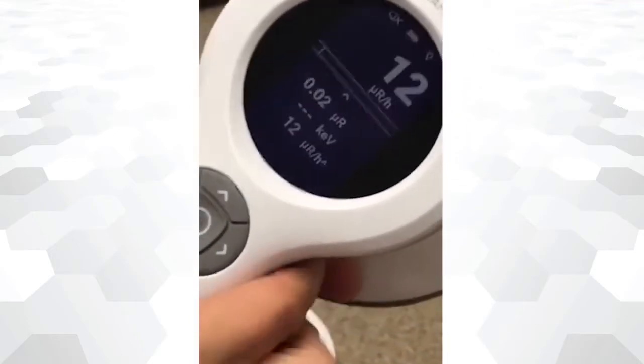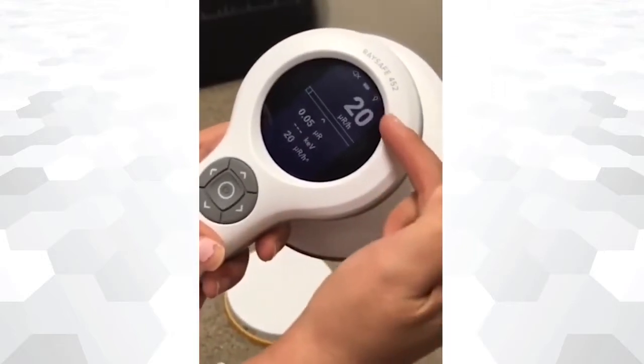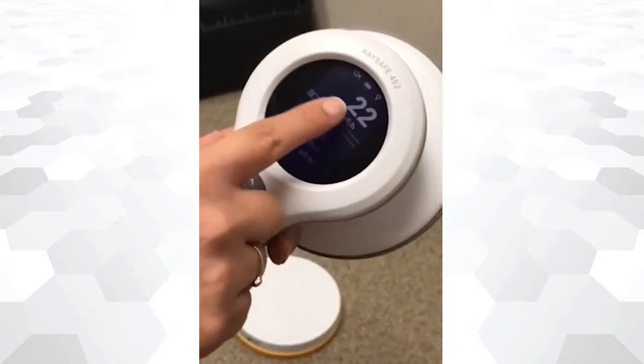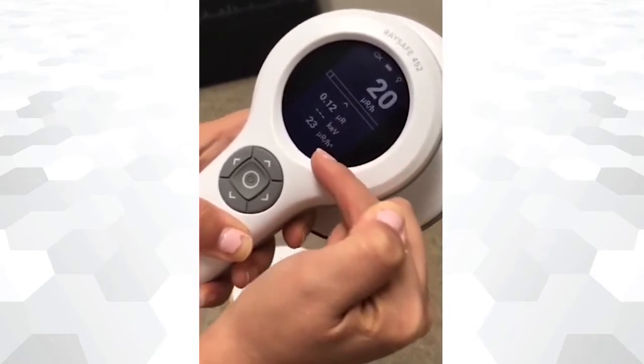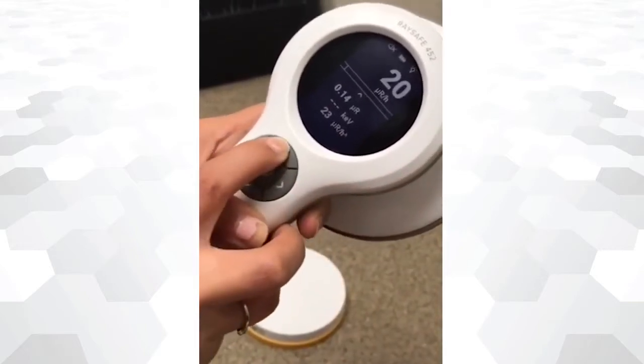At the top, you will see the current audio and light setup and battery life. The remaining screen is also composed of several rows. The first row represents the radiation intensity, the second row the accumulated dose, the third row radiation mean energy, and the fourth row is the highest intensity recorded.